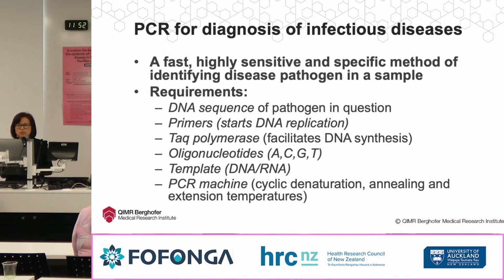PCR, as you know, only came about when we had COVID because it's a technology that we all relied on for confirmation of our infection with COVID. But it is really a fast, highly sensitive, and specific method for identifying disease pathogen in a sample.